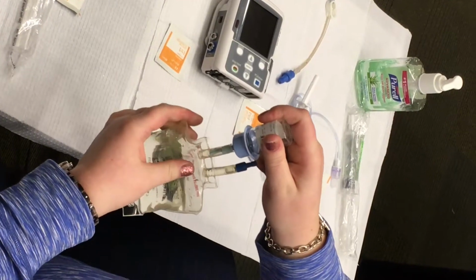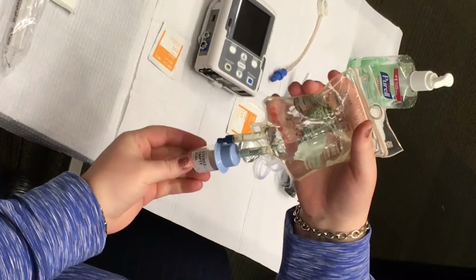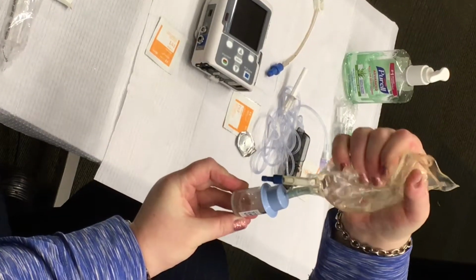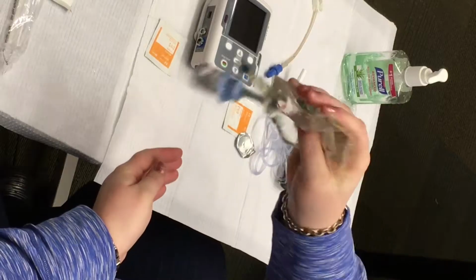Once the seal is broken, hold the bag upright with the vial on the bottom and squeeze the bag of diluent fluid until the vial is filled halfway with diluent fluid. Gently swirl the vial to mix the drug into the fluid.